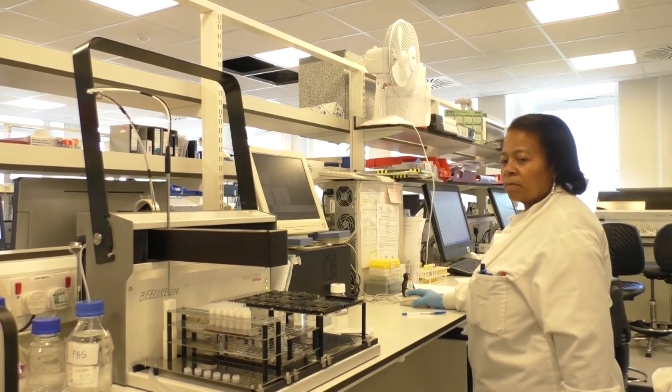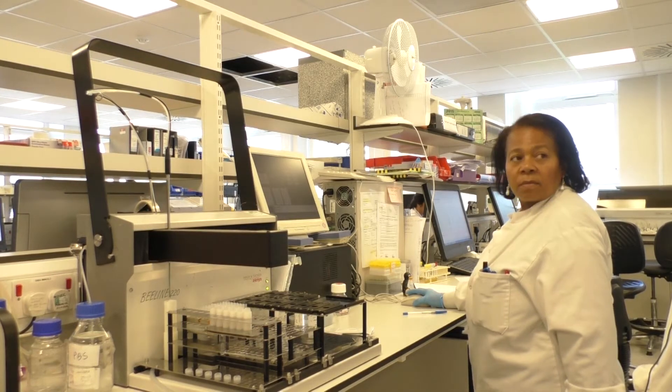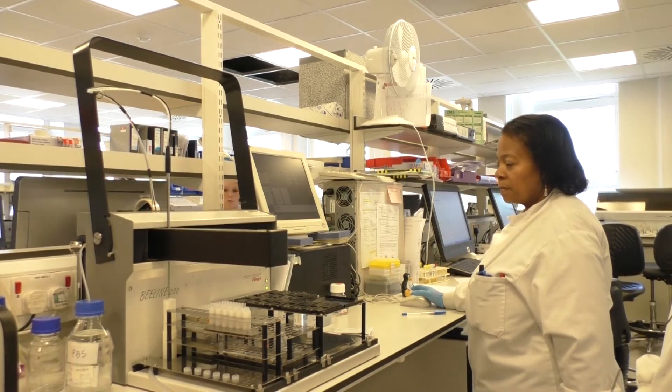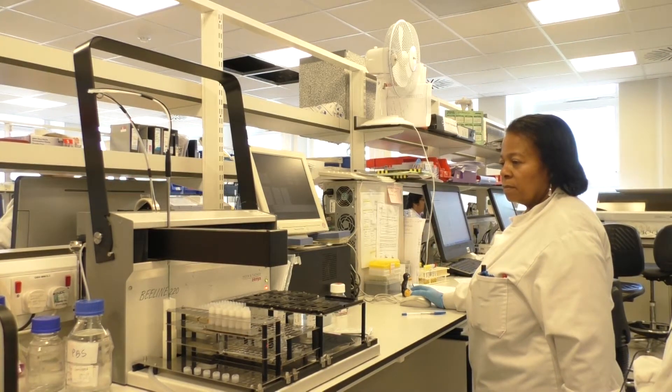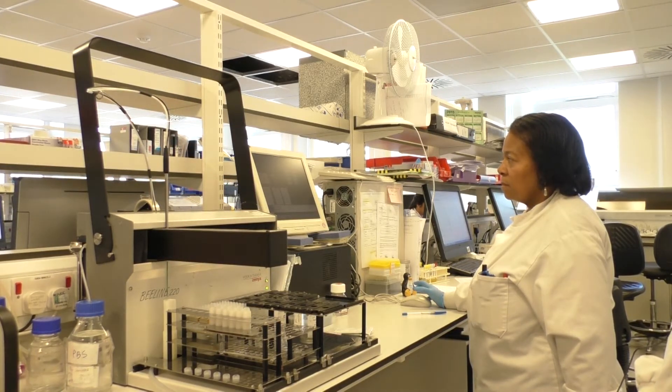This equipment is used for setting up slides for indirect immunofluorescence tests. At the moment it's priming with phosphate buffered saline, which is what we use to dilute the samples in.